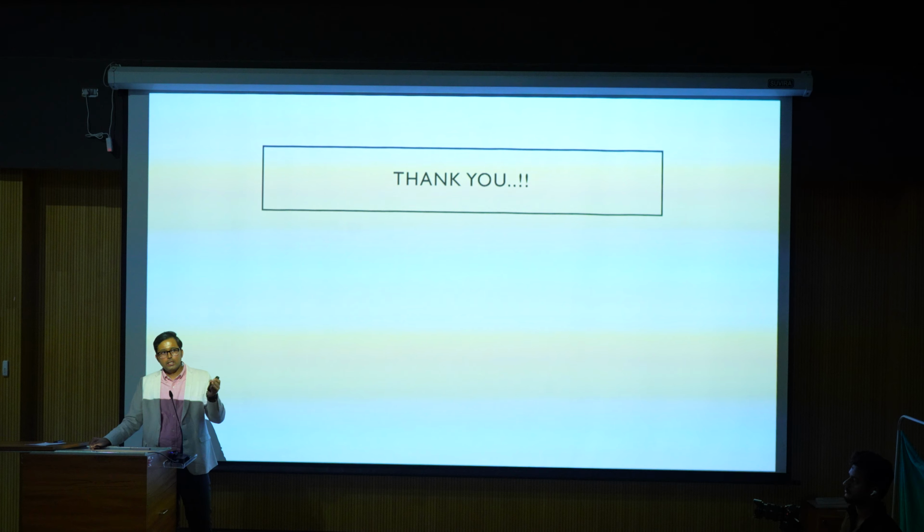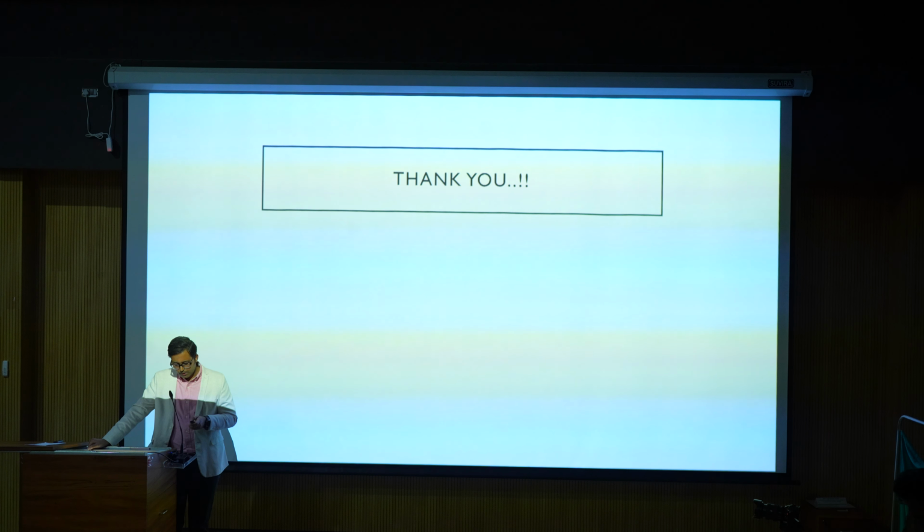Once you start applying in the normal fetuses, then only you can look at the abnormal pathologies in your practice. So it is very important, at least get accustomed to all these terminologies and then start applying it in your practice. Thank you.